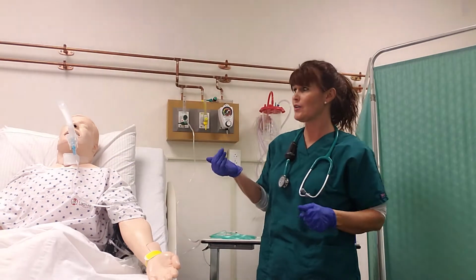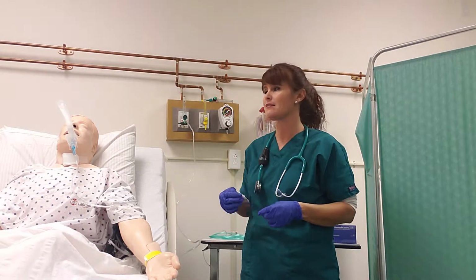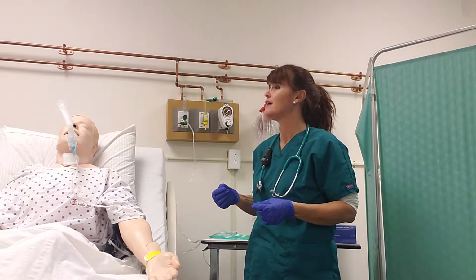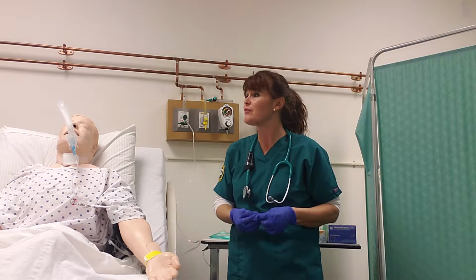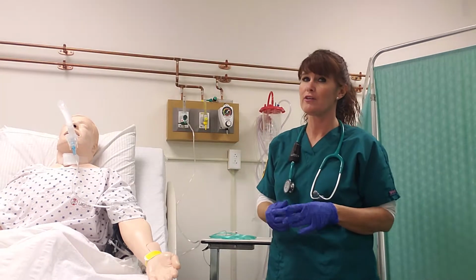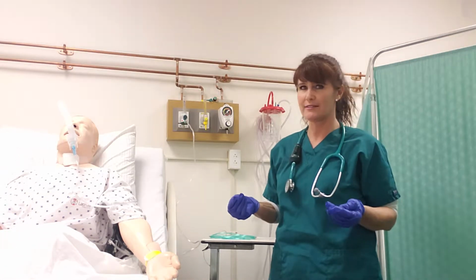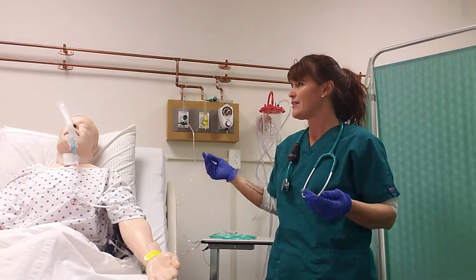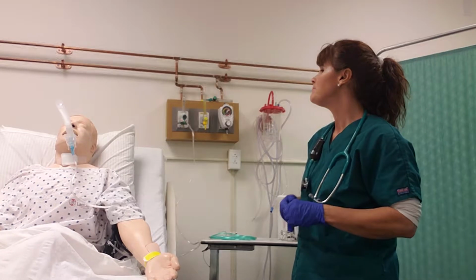Okay, and so how you're going to know that the treatment is over is it's going to start to sputter as the medication's empty. You'll see, it will no longer be spraying the mist. For safety reasons, especially if you don't know the patient very well, you're going to want to check halfway through the treatment. The treatment's probably 10 to 15 minutes, so at 5-6 minutes, reassess the patient again, look for elevated heart rate, respiratory rate, that kind of stuff.